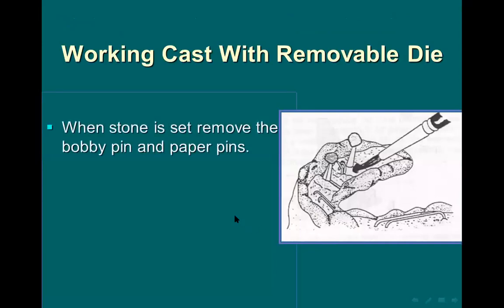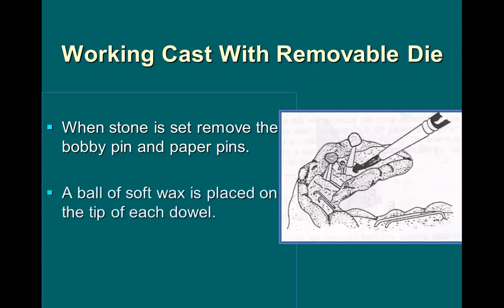After the gypsum material is set hard, we are going to apply separating medium after removing the paper clips, or the things which were fixing the dowel pin.